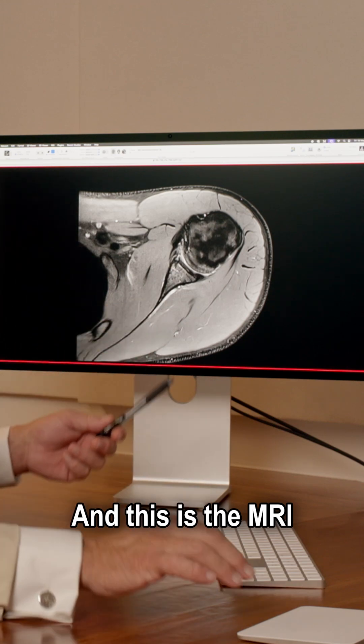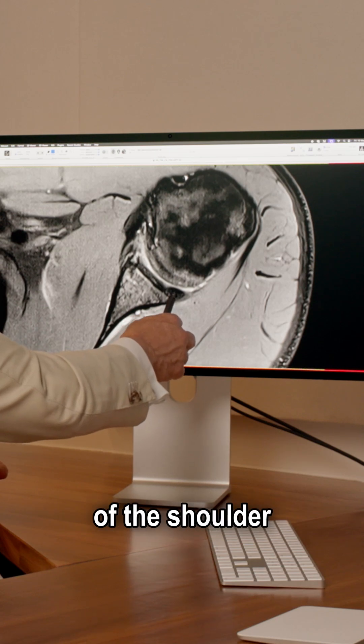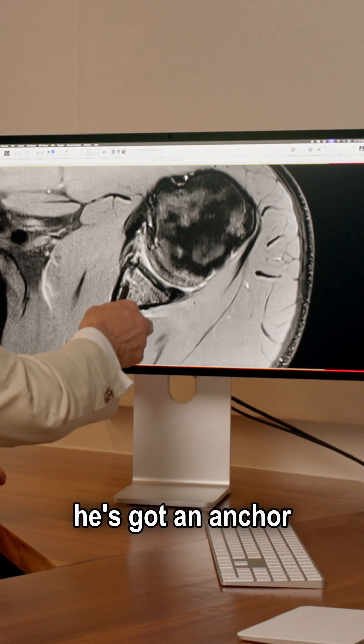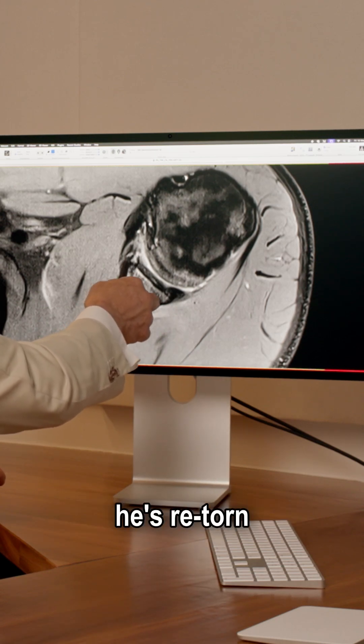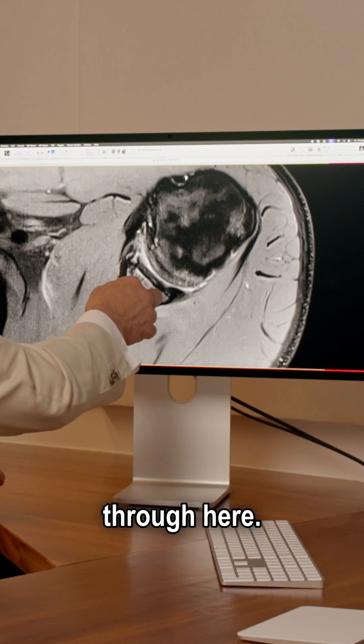This is the MRI scan now that he's come to see me with. You can see the labrum at the back of the shoulder is still intact, but at the front of the shoulder he's got an anchor point here and unfortunately he's re-torn that repair. The labrum is out through here and there's a tear line down through here.